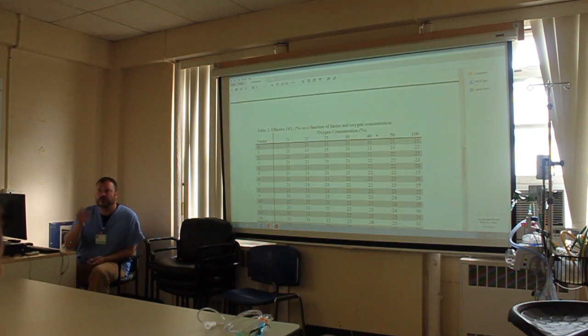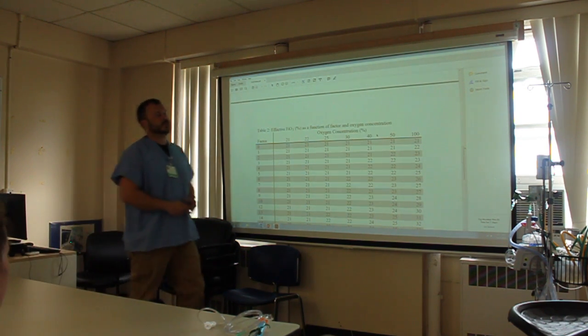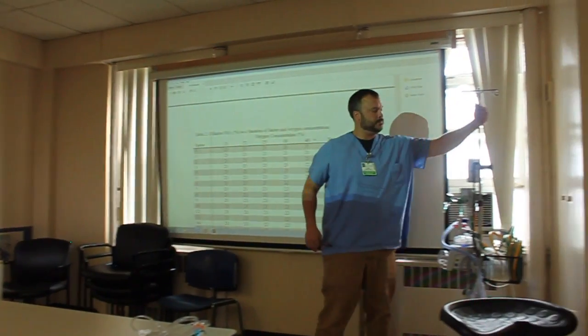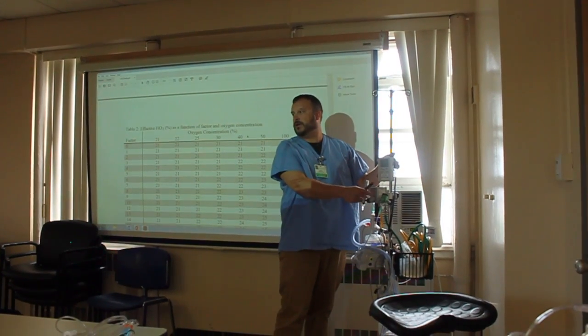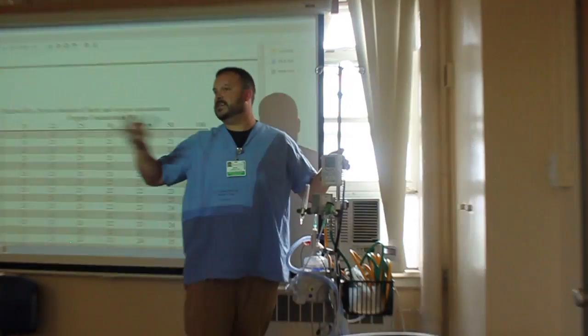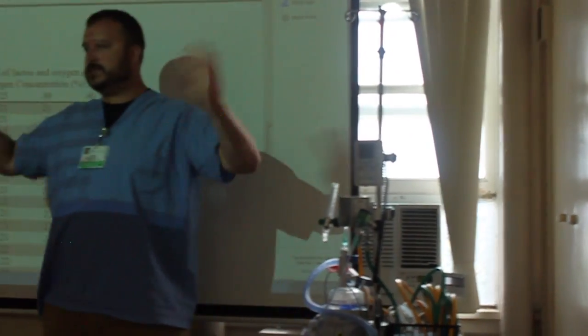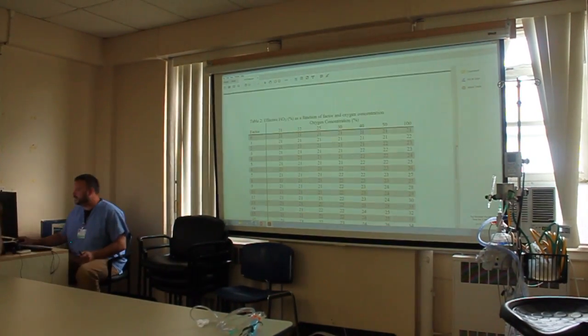So you would think, well, Ryan, you just told me 100% oxygen is coming out of the wall, but some places like NTS or the NICU or PICU, they have blenders, right? And that blender is this guy right here. And so the blender can be anywhere between 21% all the way up to 100%, right? So for you guys, in this case, it's coming straight out of the wall. That's 100% oxygen, right? You guys following me? Sort of, kind of?